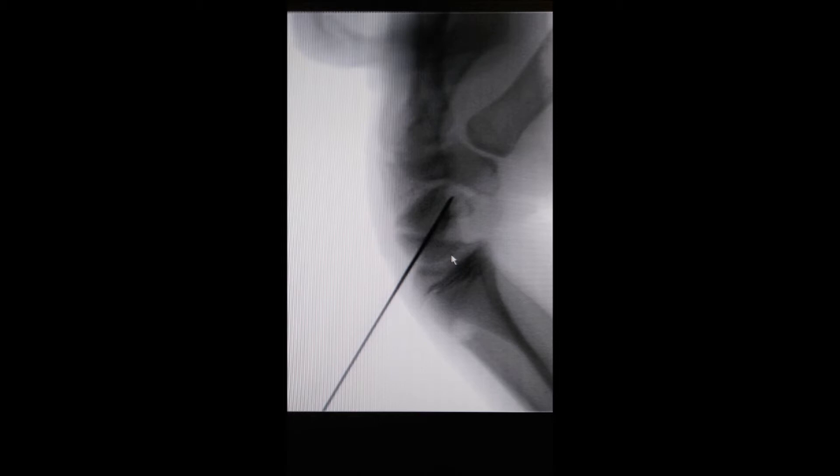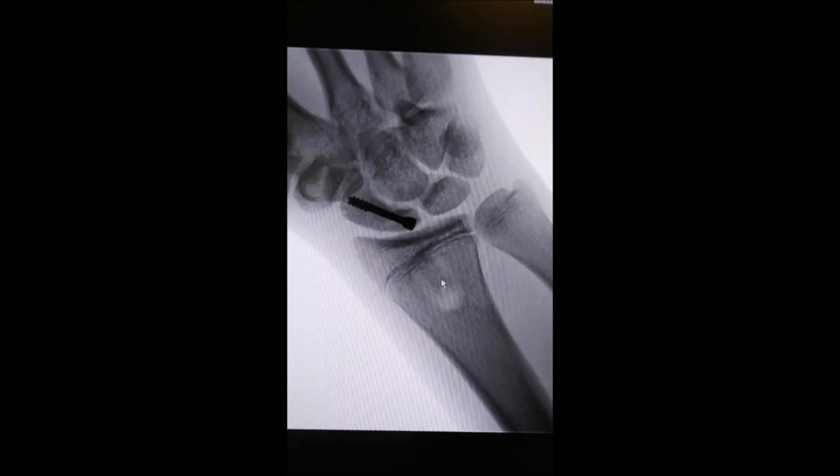This is another view of the same bone which is fixed with a pin. Then we go ahead and proceed to fix it with a small headless screw. The screw is buried deeply in the bone and it stabilizes the bone until the fracture unites.